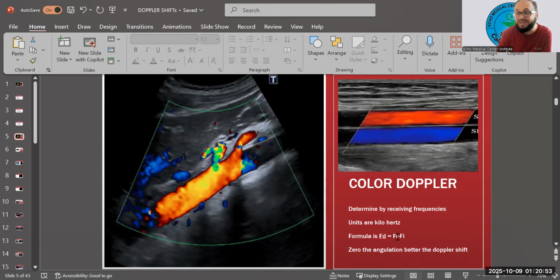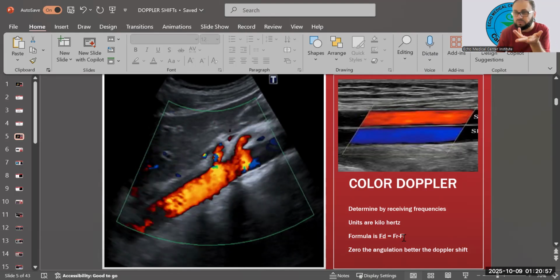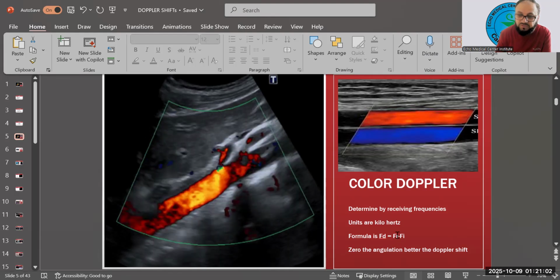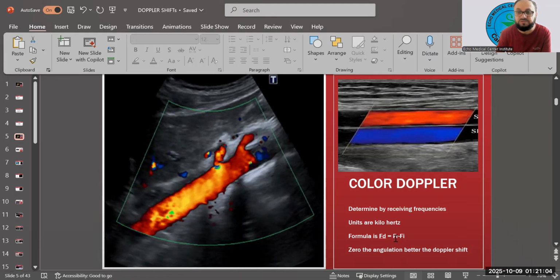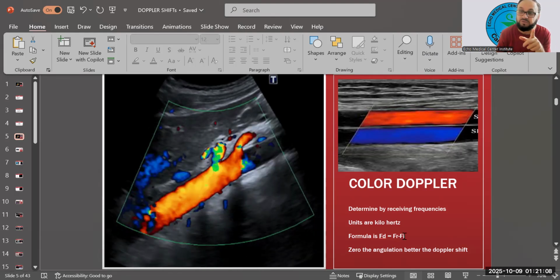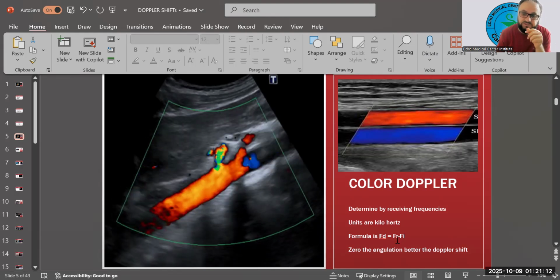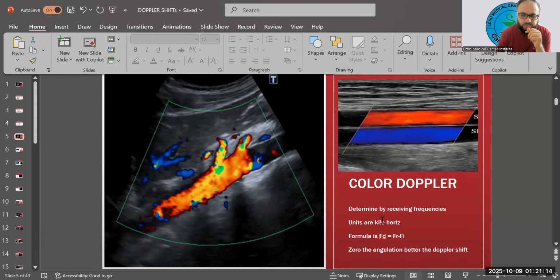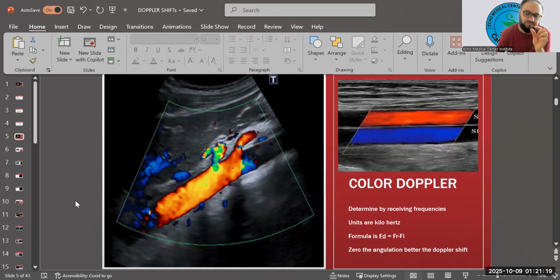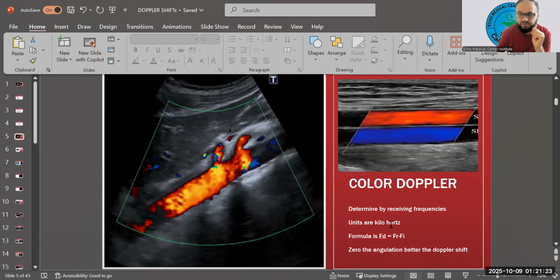You can see the reflecting frequency minus the initial frequency, or operating or transducer or starting frequency, same thing. So remember, our dominant factor here is the reflecting frequency. The Doppler shift will be selected by the reflecting frequency because your initial frequency is constant. That's not changing. So the only change will be seen in the reflecting frequency. And again, somebody may ask, because this Doppler shift is very little, that's why the unit for it is kilohertz, not megahertz.